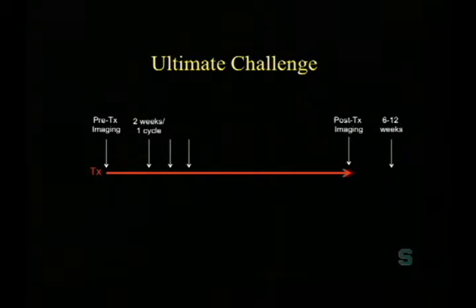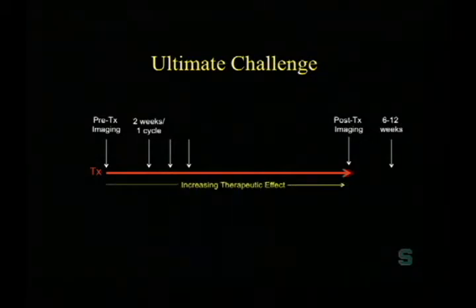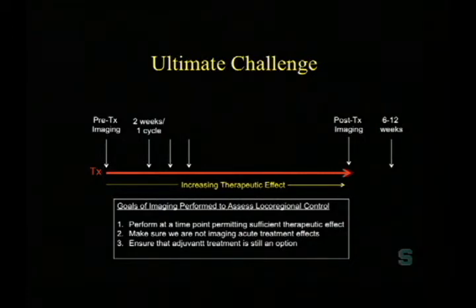Or we'll try to do imaging immediately after treatment. But what I'll say is the following, is that the challenge is that as you wait during your treatment, you have this increasing therapeutic effect. And the goal of this imaging is to try to perform the imaging at a time that permits sufficient therapeutic effects.